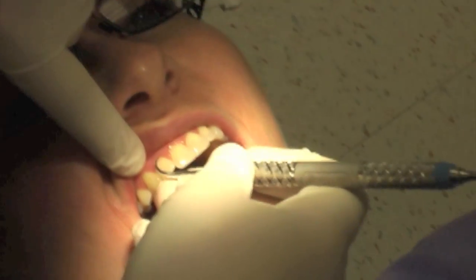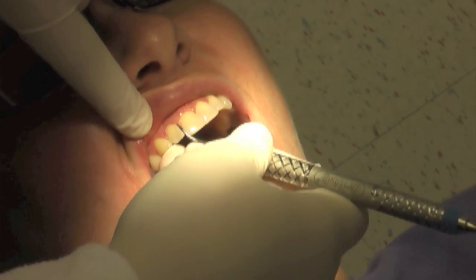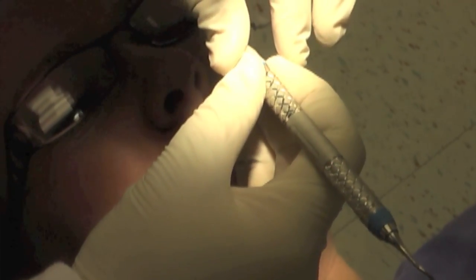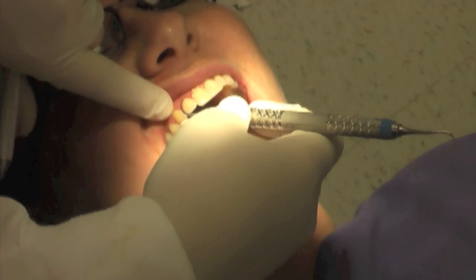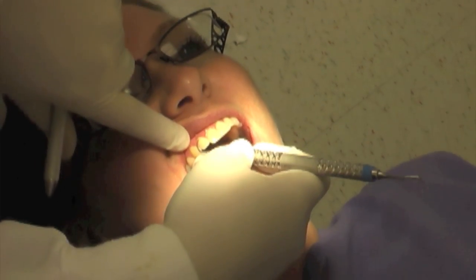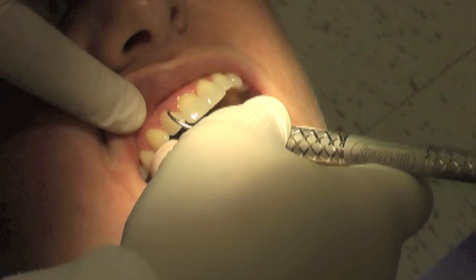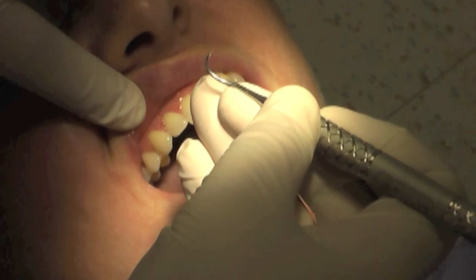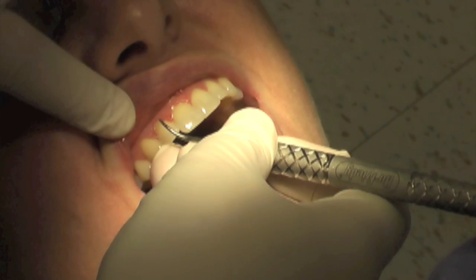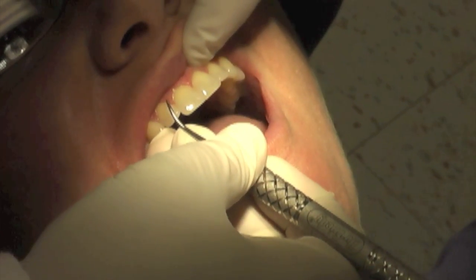Activate your instrument — you don't want to do this. You see what I'm doing as opposed to this? This is a rocking motion that involves moving my entire hand and my wrist. The only fingers that are moving are these two fingers because they're twisting the instrument. Remember when we talked about this before — you always want to think about lateral pressure, and then you want to be moving the direction the toe's facing and twist. I always say: toe to the tooth, go toward the toe in direction, then twist and twist. You're not going to be able to get a piece of heavy deposit off the tooth just using finger strength. You need to be able to go laterally and toward the toe.